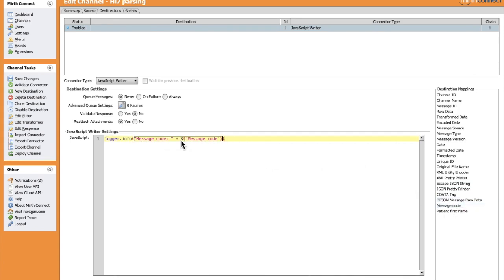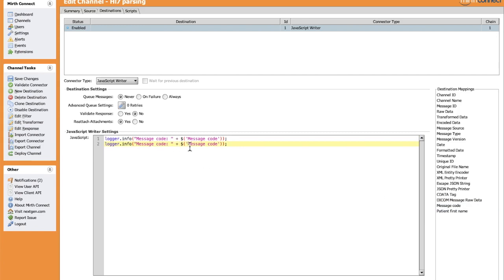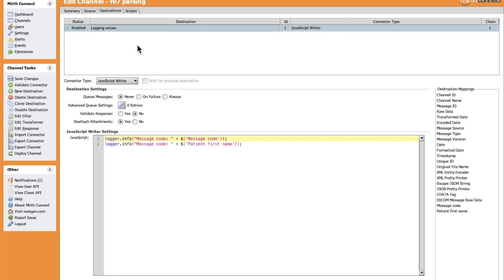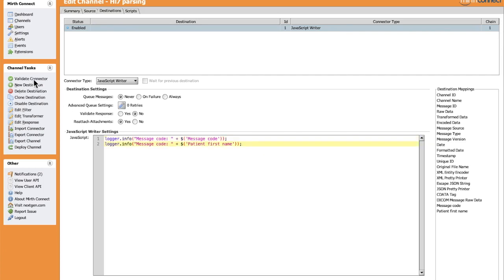As you see, by drag and drop here and here, we can just change the string to specify the value of the patient first name. Let's give our destination a name, for example Logging values. Let's save, and after that, let's deploy the channel to run it.